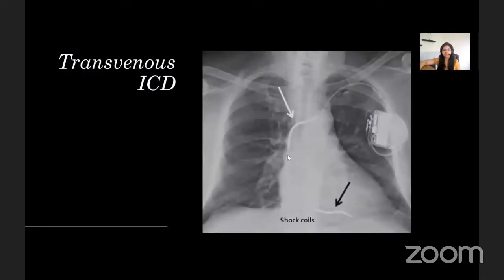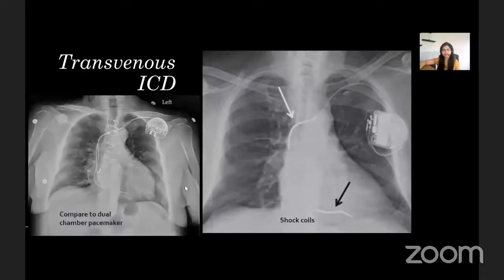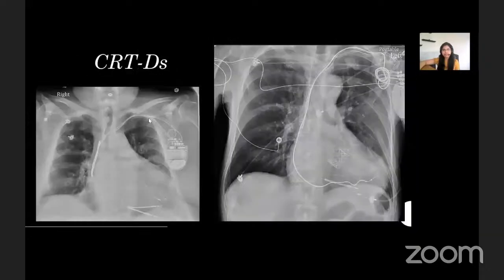Transvenous ICDs contain a lead with either one or two metal shock coils. Note the shock coil placed at the brachiocephalic vein and superior vena cava junction and a distal shock coil in the right ventricular apex. Also note the difference in thickness of the shock coil compared to the pacemaker lead. Transvenous ICDs are often combined with biventricular pacemakers to provide resynchronization therapy to high-risk heart failure patients; these are called CRTDs. Note the combination of pacemaker leads and shock coils in these radiographs.